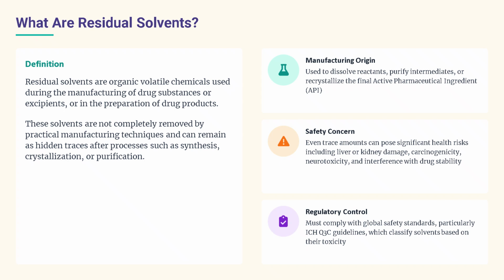Residual solvents are like silent passengers in your drug product. They come from the manufacturing process. Solvents used to dissolve reactants, purify intermediates, or recrystallize the final API. And while most of the solvent evaporates during processing, tiny amounts can remain trapped in the crystal lattice or formulation.